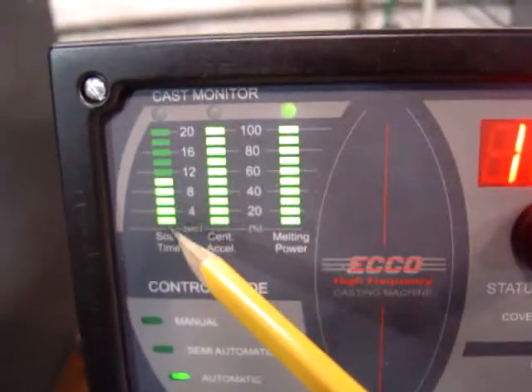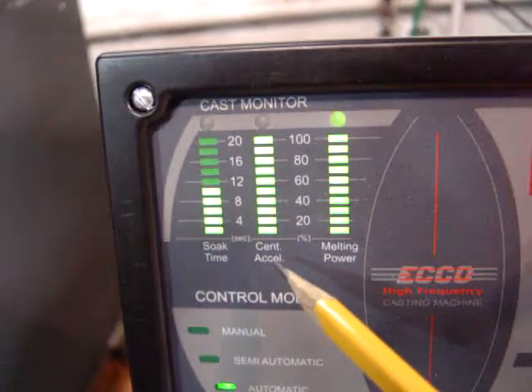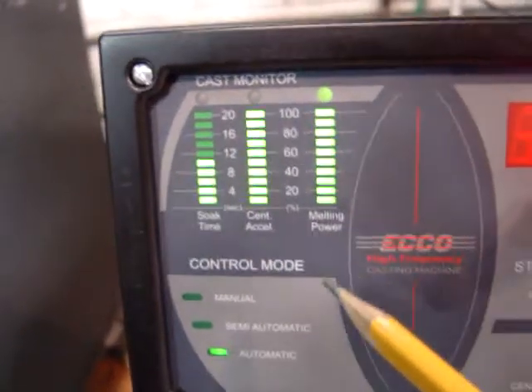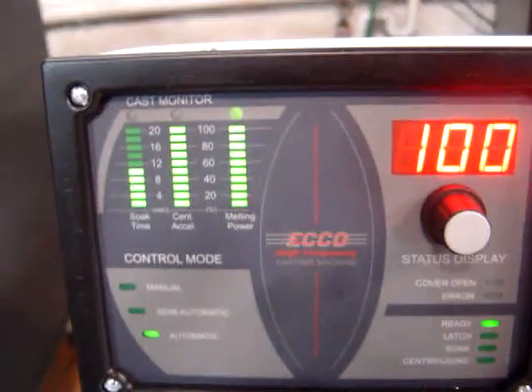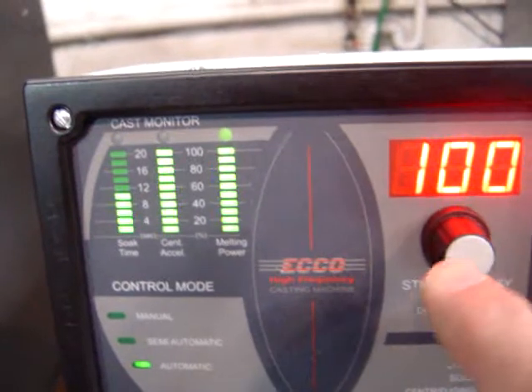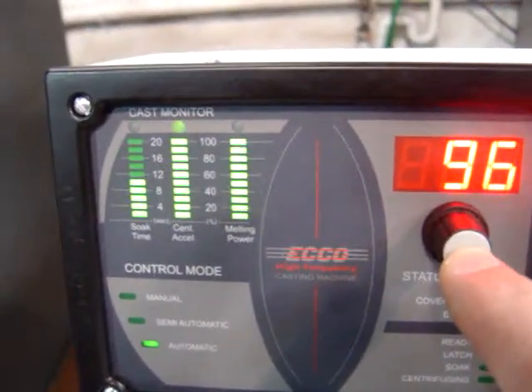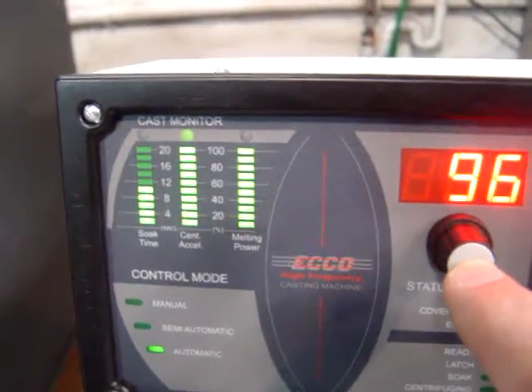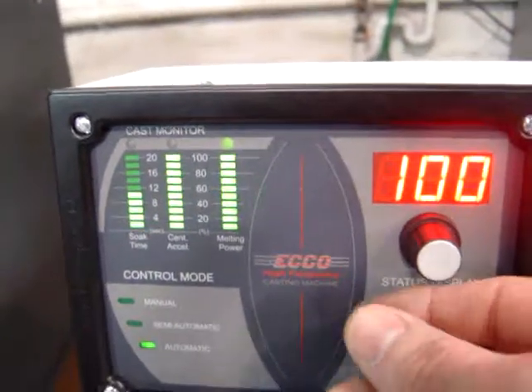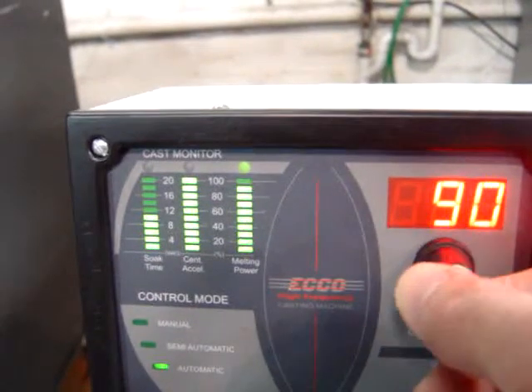Over here we have our three parameters: our soak time, our acceleration on the centrifuge, and the melt power. These are all adjustable by scrolling through with this button here, pressing in, and you'll notice that above each parameter the LED lights up, and this allows you to adjust the given parameter up or down — in this case the power setting.